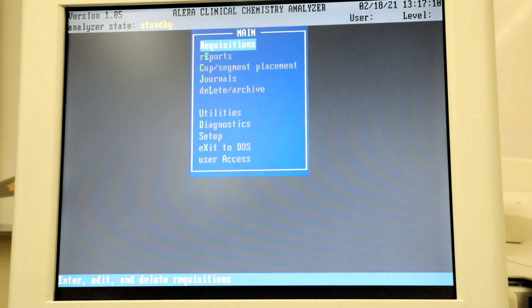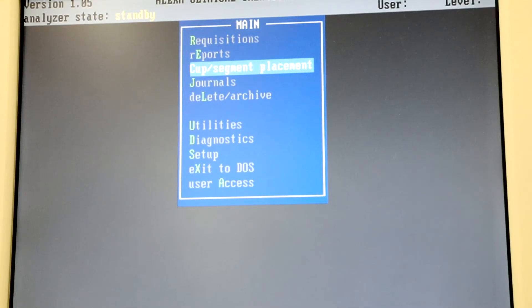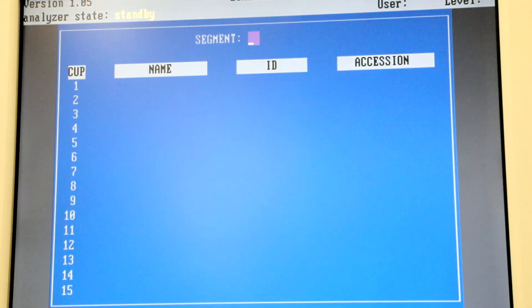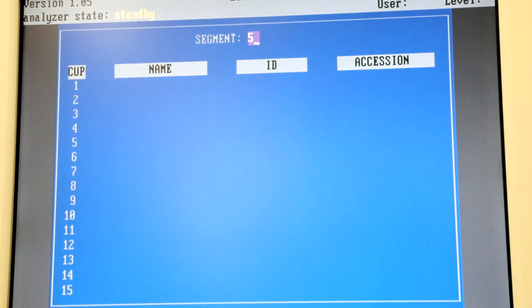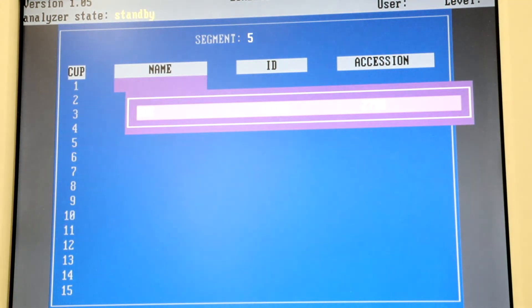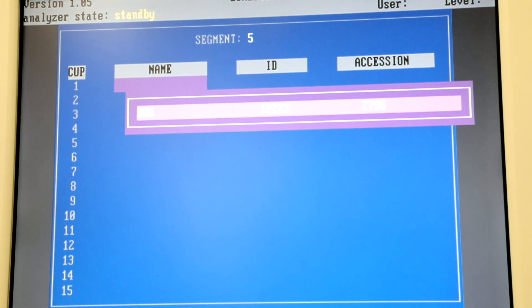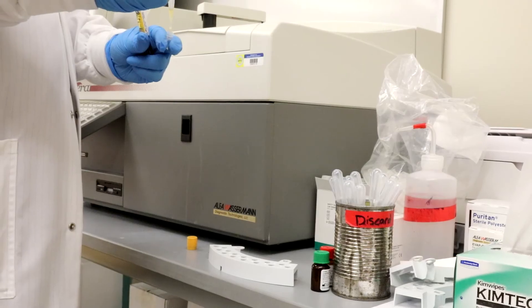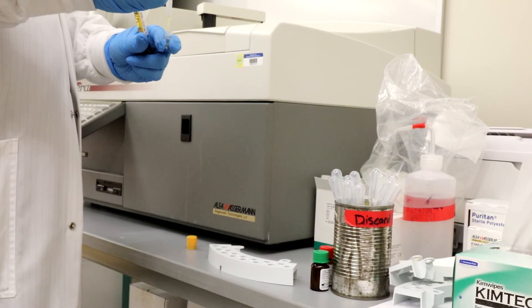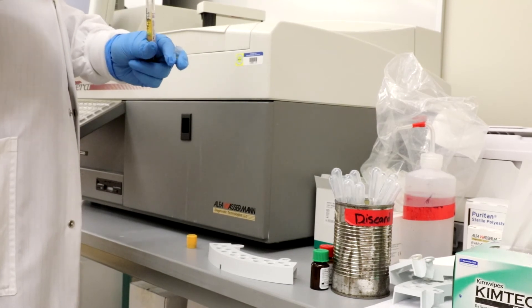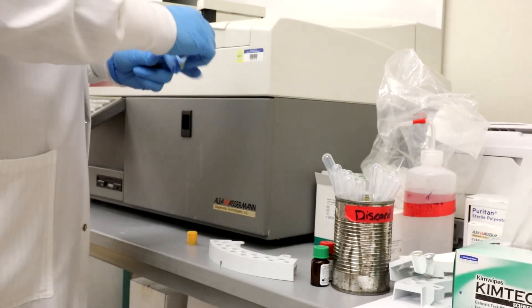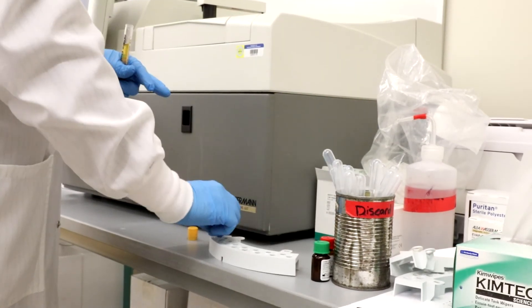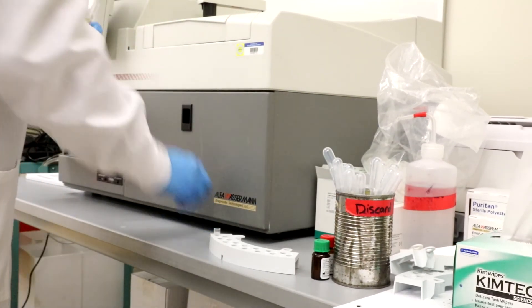Next select C for Cup Segment Placement. Assign the segment a number and then hit Enter. Hit F12 to bring up a list of patients with orders and select the desired patients. Place a few drops of patient sample into a cup and place it on the segment by the corresponding number.